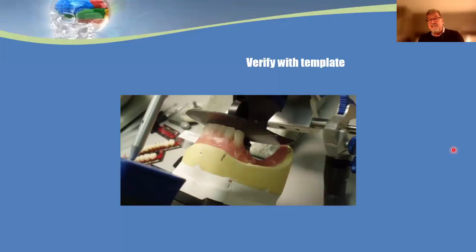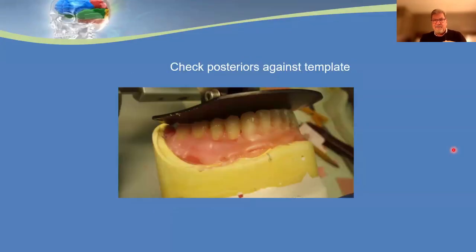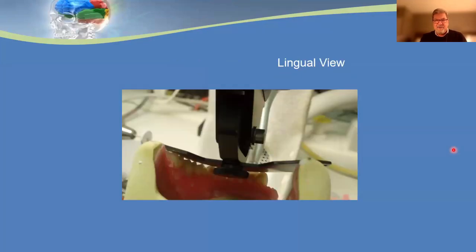So I'm going to set all my lower teeth. Curve template on the RTEX articulator. I set all my posterior lower teeth to the template here. Everything's nice, looks great. Right on the ridge, I got my Curve of Wilson, Curve of Spee. Look how nice those contacts are on the template here.